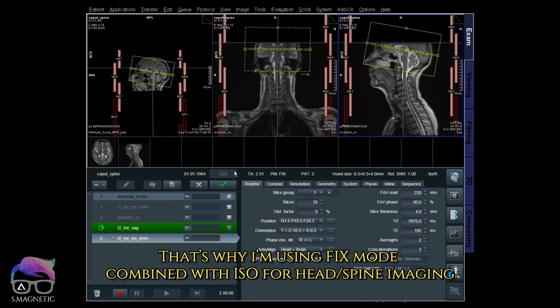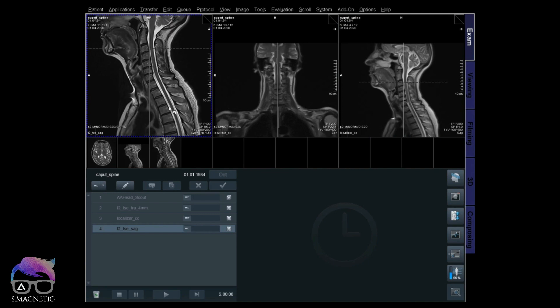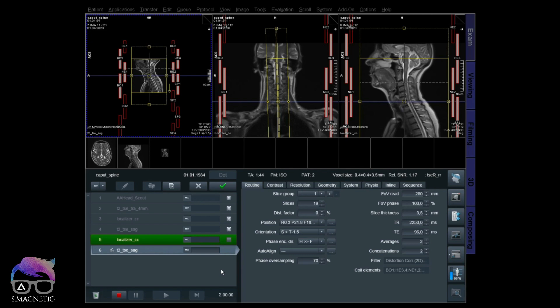That's why I use the fixed mode for the head in combination with isocenter for the spine. I know it's very difficult to understand this the first time - you just have to try it out yourself. I hope this video explains how it works in practice. It took me a really long time to understand the difference between fix and reference. ISO is easy because the field of view moves when you move your yellow box. I couldn't understand the fix vs reference difference until I saw this head-spine combination example.